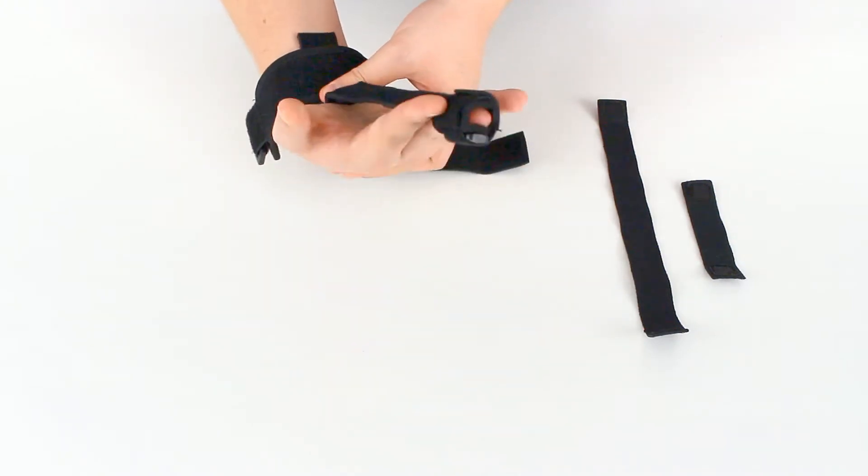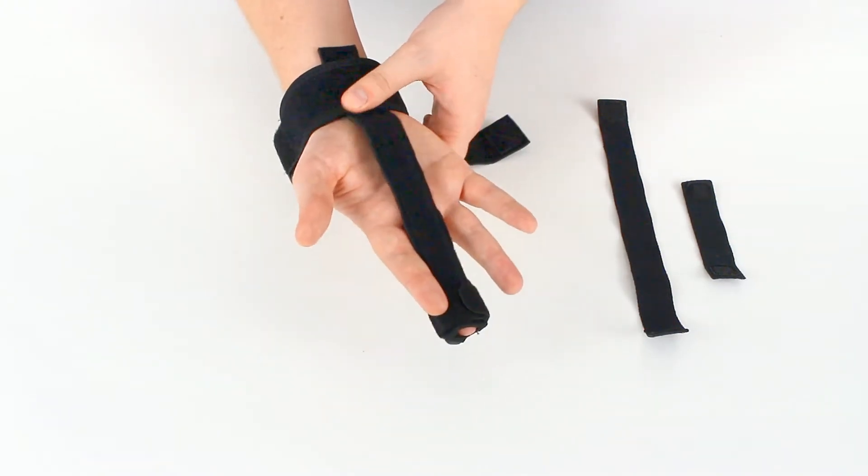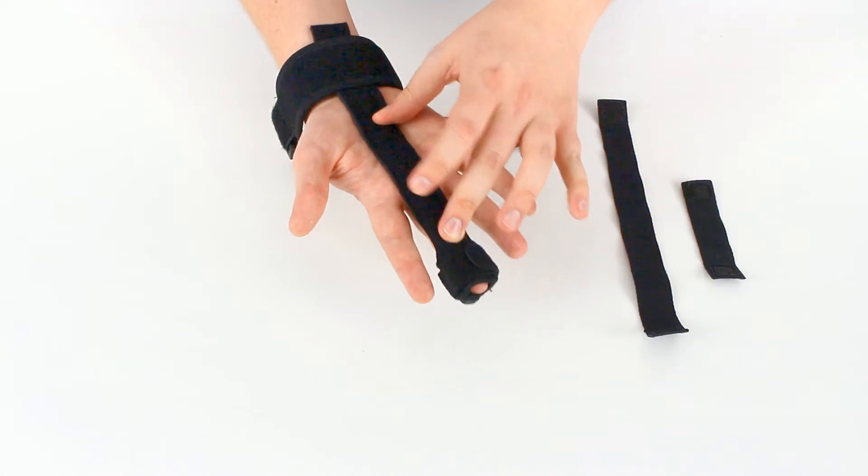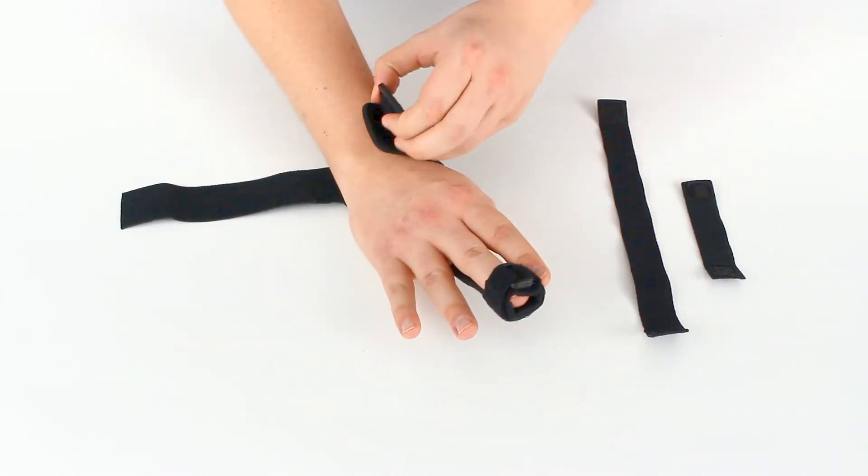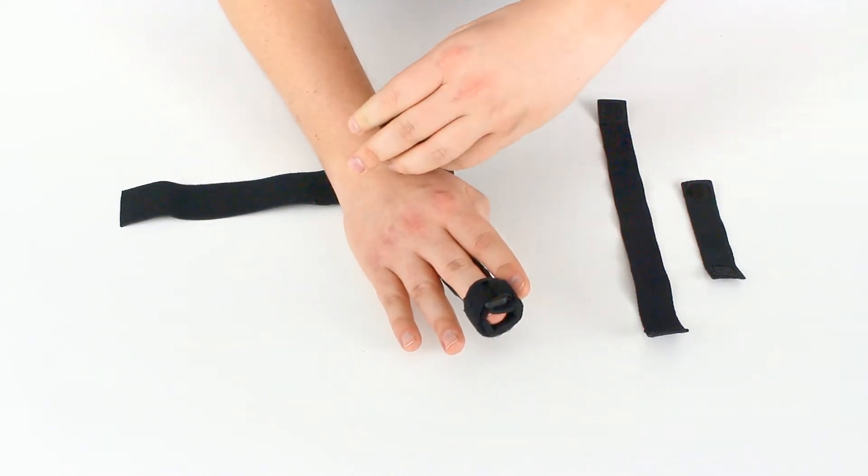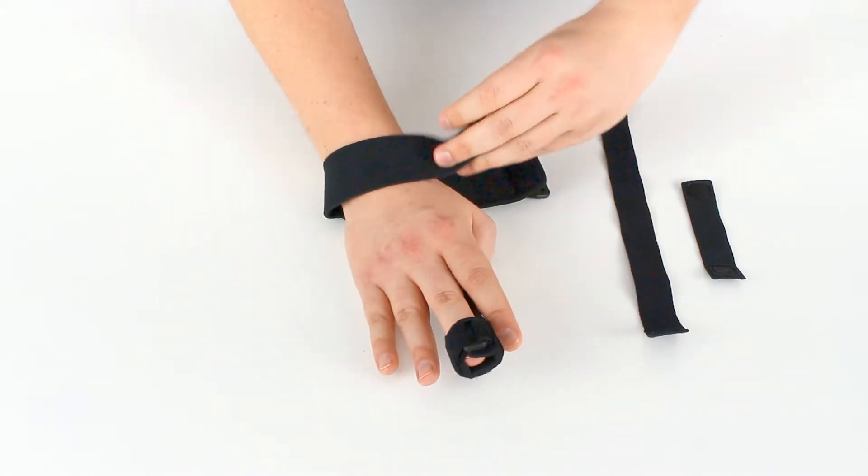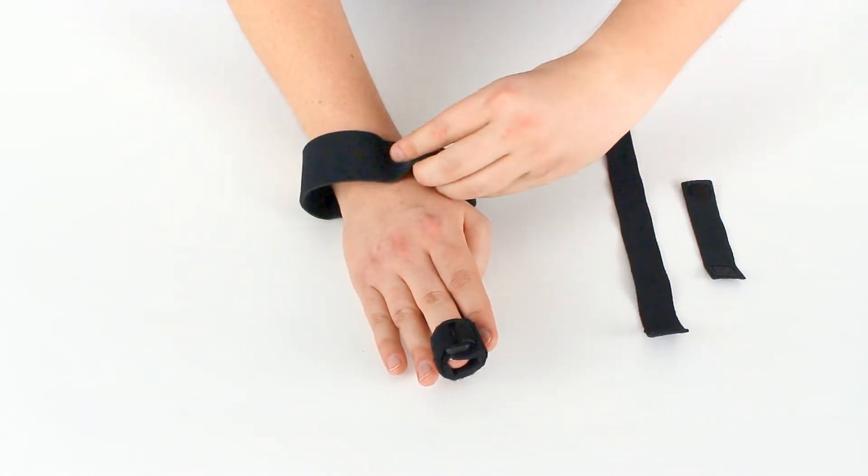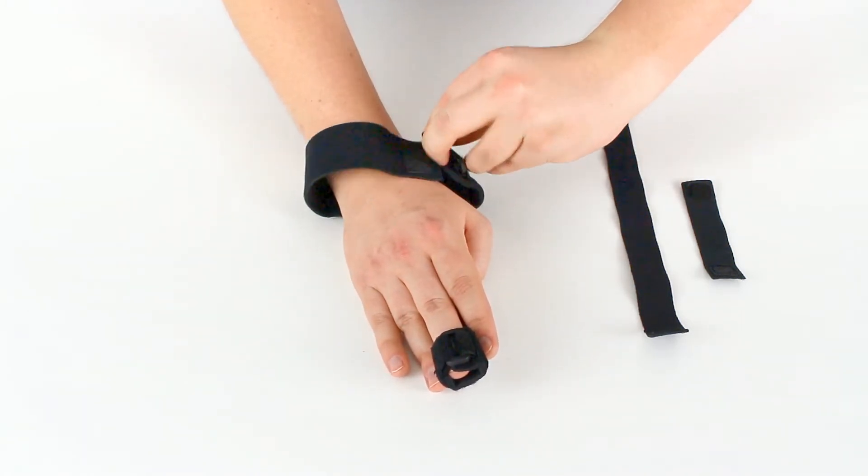That will still allow our hand to move a little bit if needed but it will keep the splint in place on our hand. Bring the strap around. Get that through.